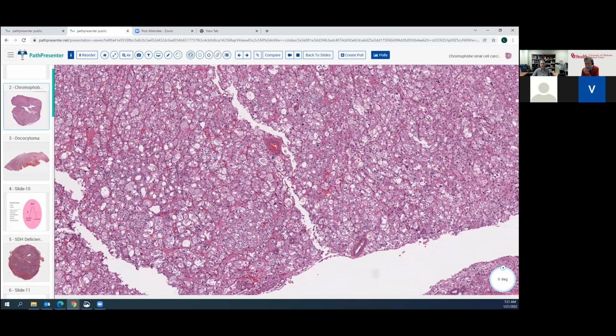So here is our next pink tumor that you guys had in your slide deck to preview. Laura, before you go on, there is a question in the chat about whether or not you would also consider LOT versus HOT. And I'm not clear on what those abbreviations are. I am not either. Would you mind spelling those out for us? Kalyani, do you want to just unmute yourself and speak up?